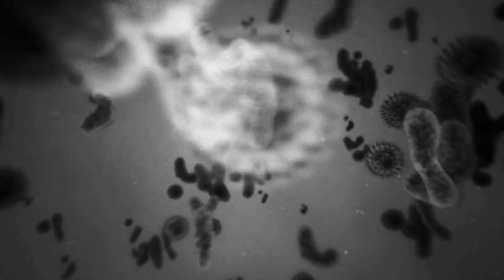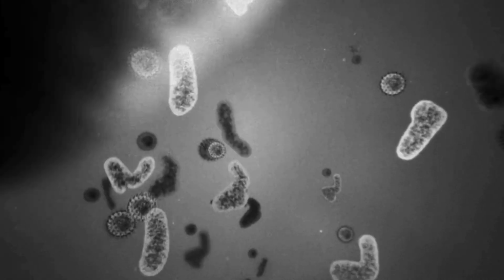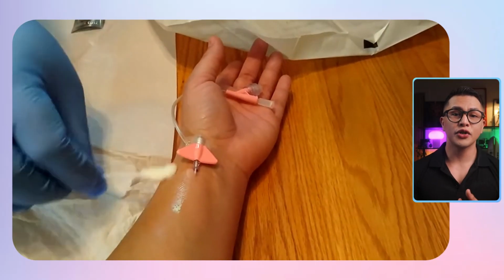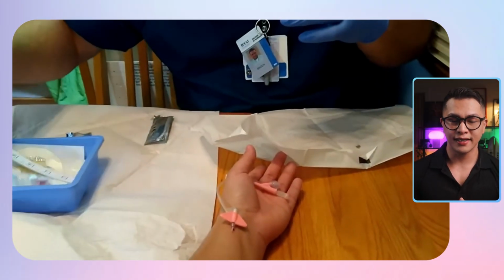Now, let's talk about the complications that keep me up at night, because these are the ones that can seriously harm your patient. Infection is always a risk with any invasive lines. Watch for redness, swelling, and drainage at the insertion site. Change the dressing according to your facility policy, usually every 7 days with transparent dressings.